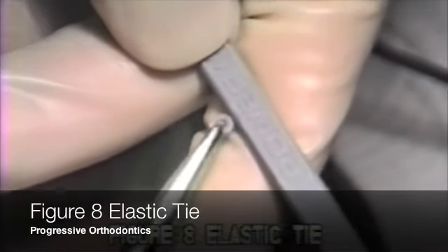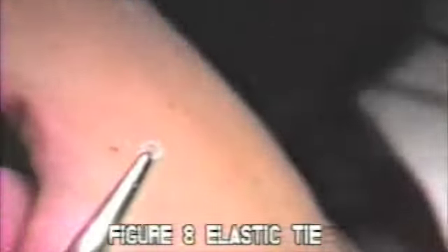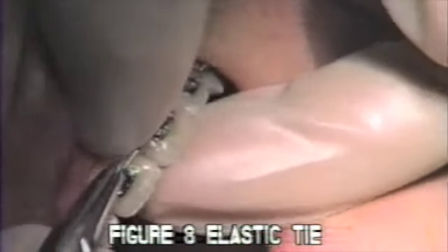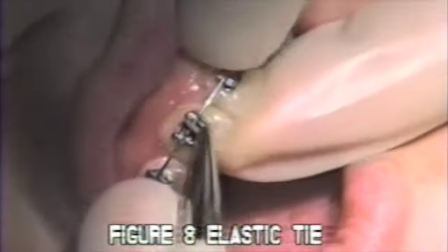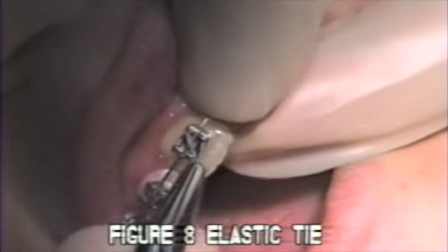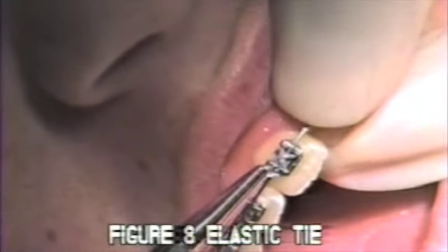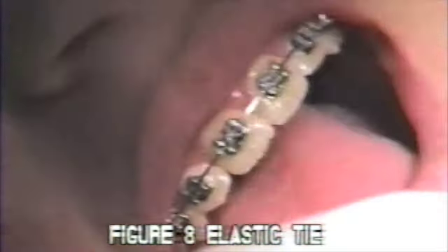If the wire is passive in the slot, use a figure eight elastic for a tighter tie. This tie holds the arch wire between the mesial and distal tie wings. This is very helpful when trying to obtain a tight tie on rectangular wire to hold it firmly into the slot.